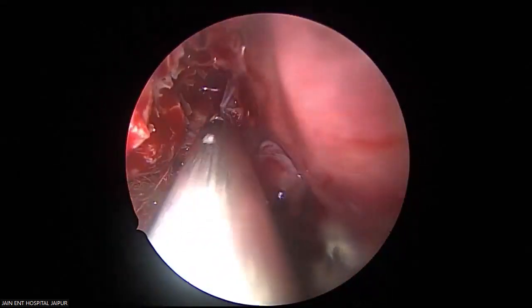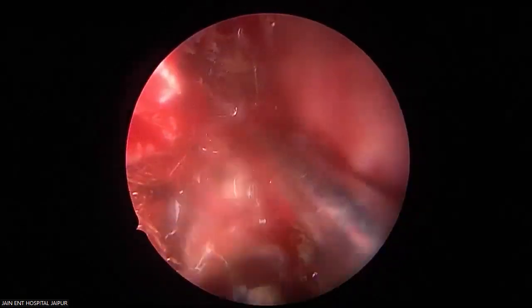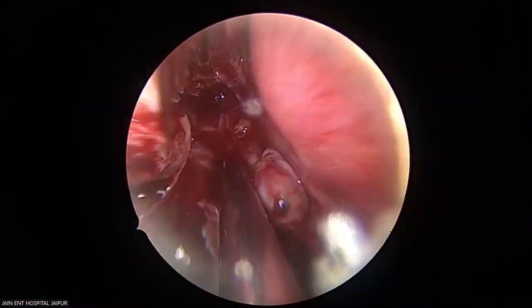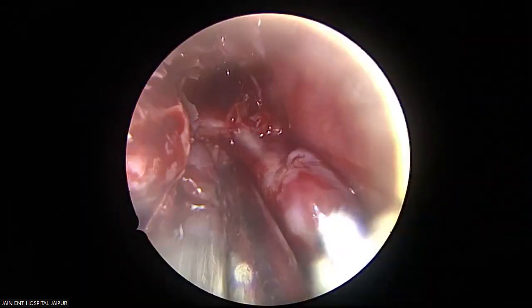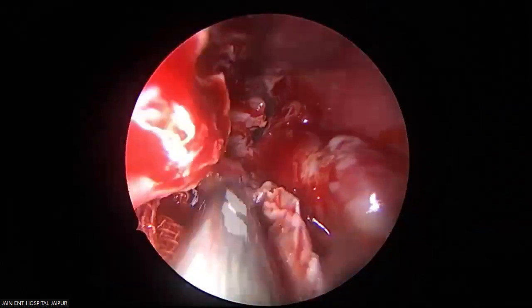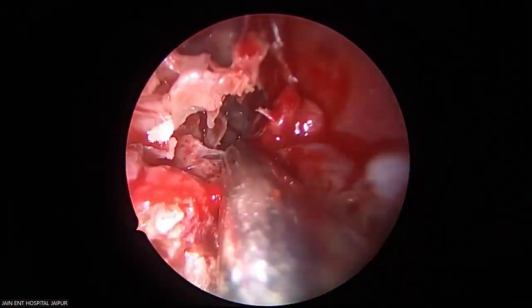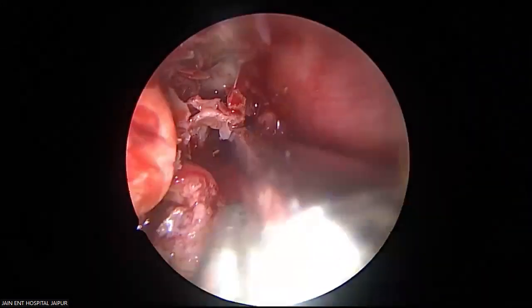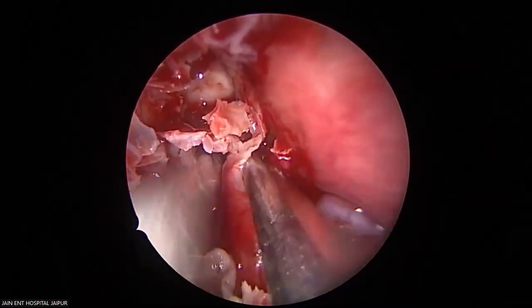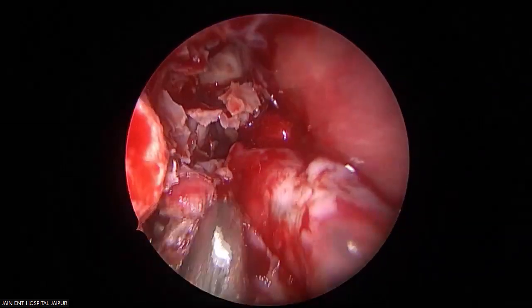See the tumor going up? See the tumor there? This is the tumor there. And that is the sphenoid sinus behind. Pass the close.